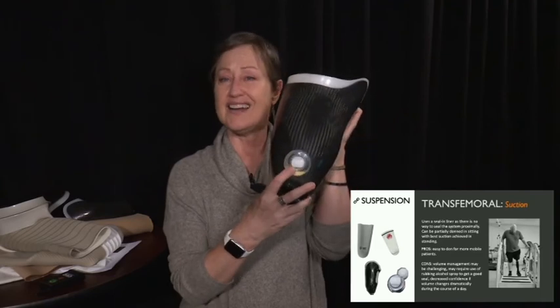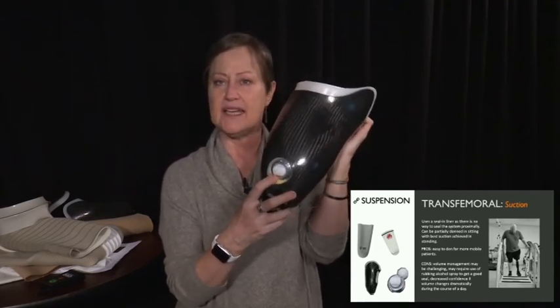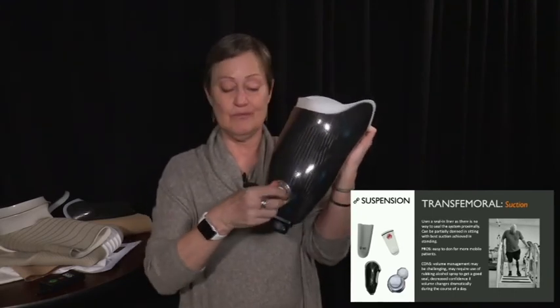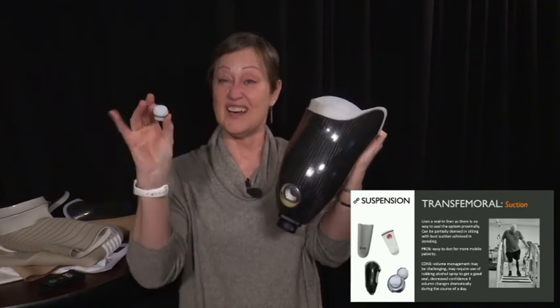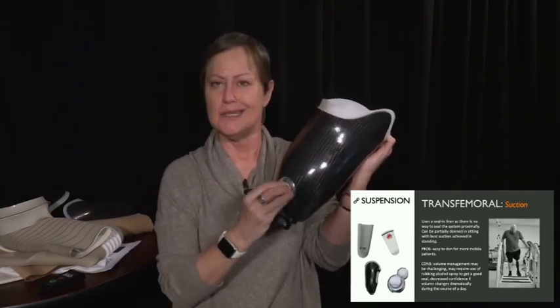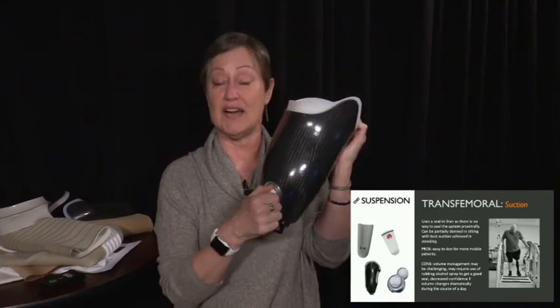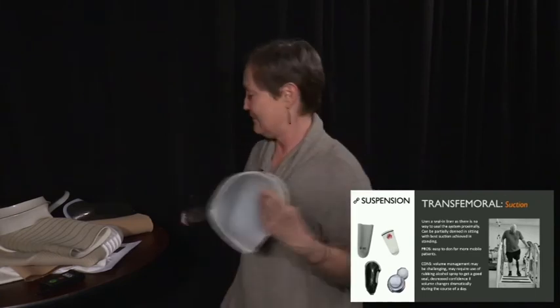That is kind of handy, I think, for us as therapists to know exactly where somebody is in their socket. A little tip for you, and for your patients: these things are expensive. They're only going to get one. They're a few $100. One of my patients had one fly across the room, and I don't know if his dog ate it. I can't remember what happened to it, but he could not find it to save his life. So they're expensive. Let your patients know.